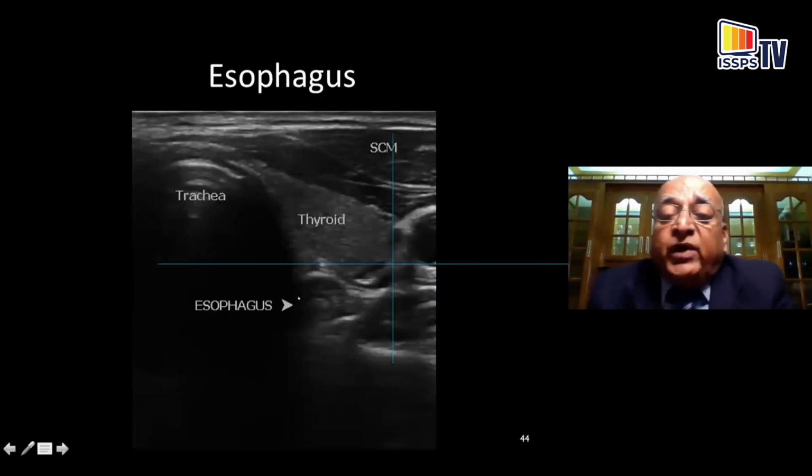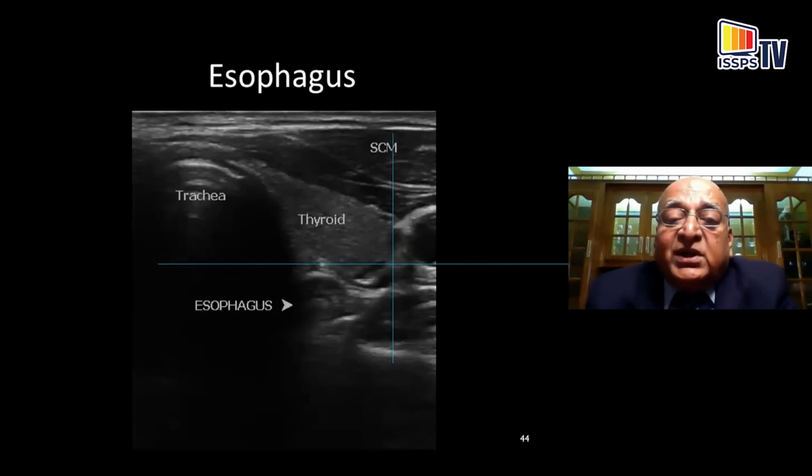Talking about swallowing, you definitely want to make sure that you locate the esophagus. People have injected into the esophagus, and it's a total waste, as well as the potential for causing infection or spread of infection from that area. So you want to ask the patient to swallow, and air bubbles will be seen floating down as you locate the esophagus.